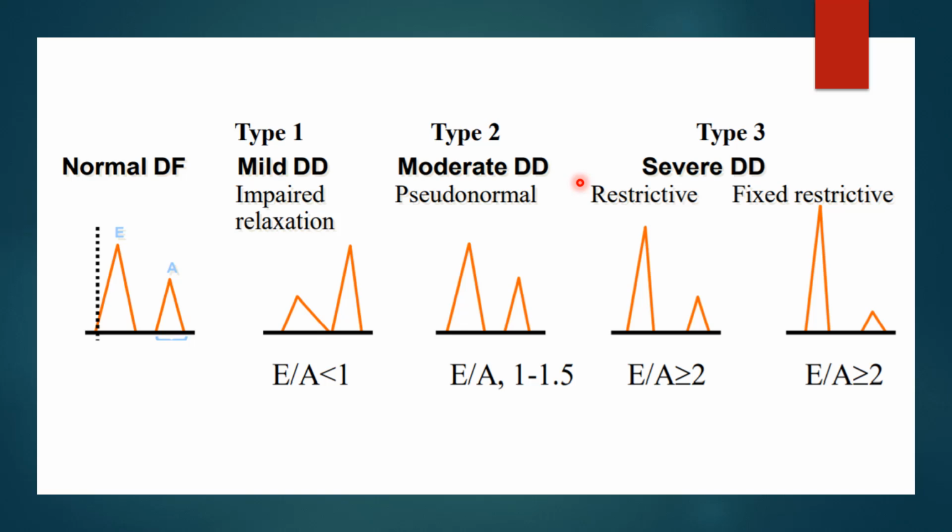The mitral Doppler pattern. So this is blood velocity. We'll talk a little bit about this going forward, but these are the basic patterns.